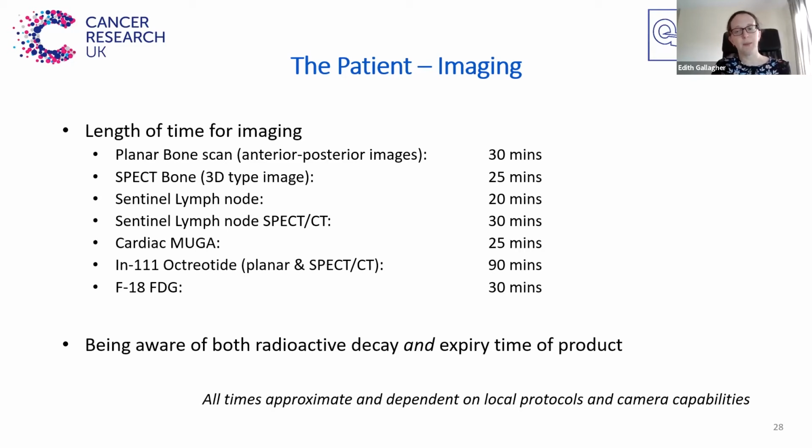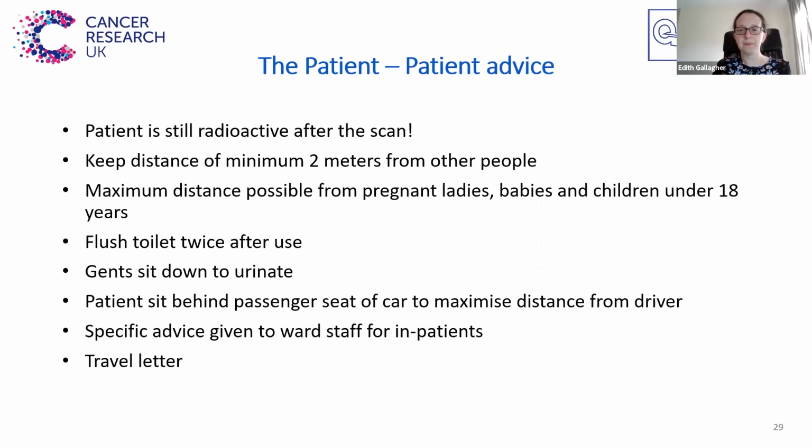Also, as well as thinking about how much radioactivity you have left, you have to think about the expiry time of the product. As has been mentioned by Jen and Maita, the radiopharmaceuticals are usually made very early in the morning, and their shelf life may mean that they have expired by, say, 2 o'clock that afternoon. I'm sure you can appreciate that from this slide and the previous one, getting the timings right is very important.